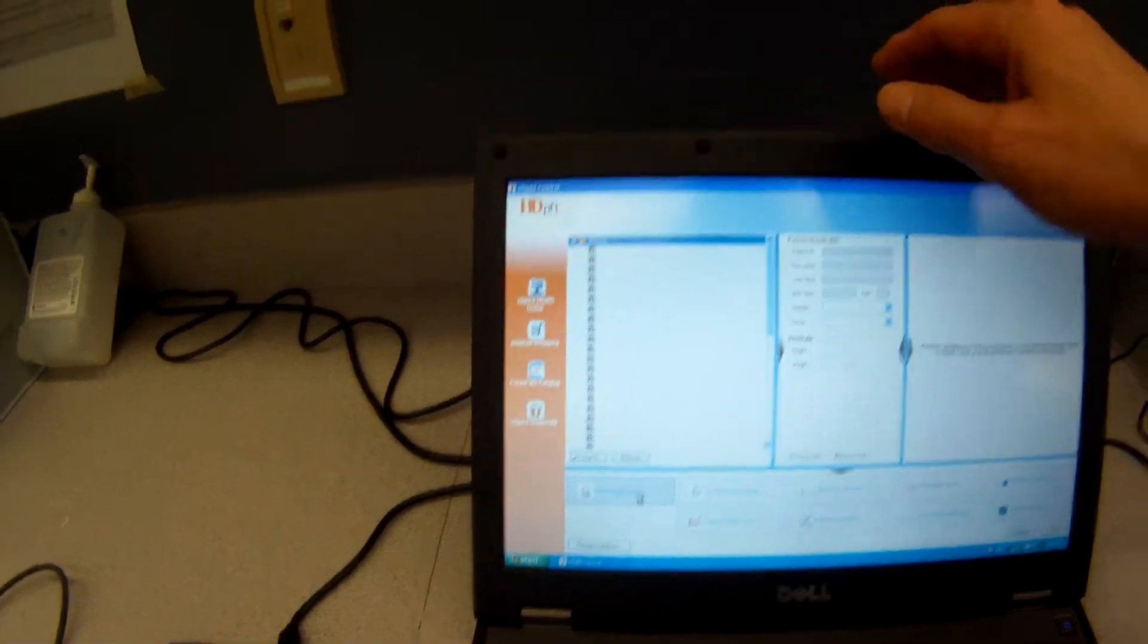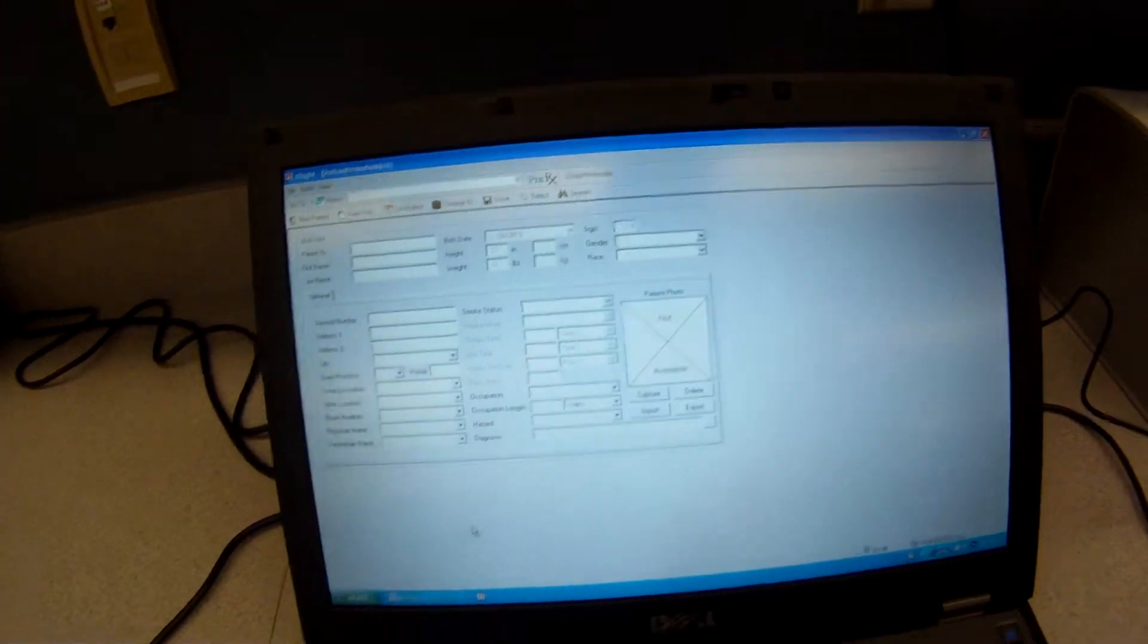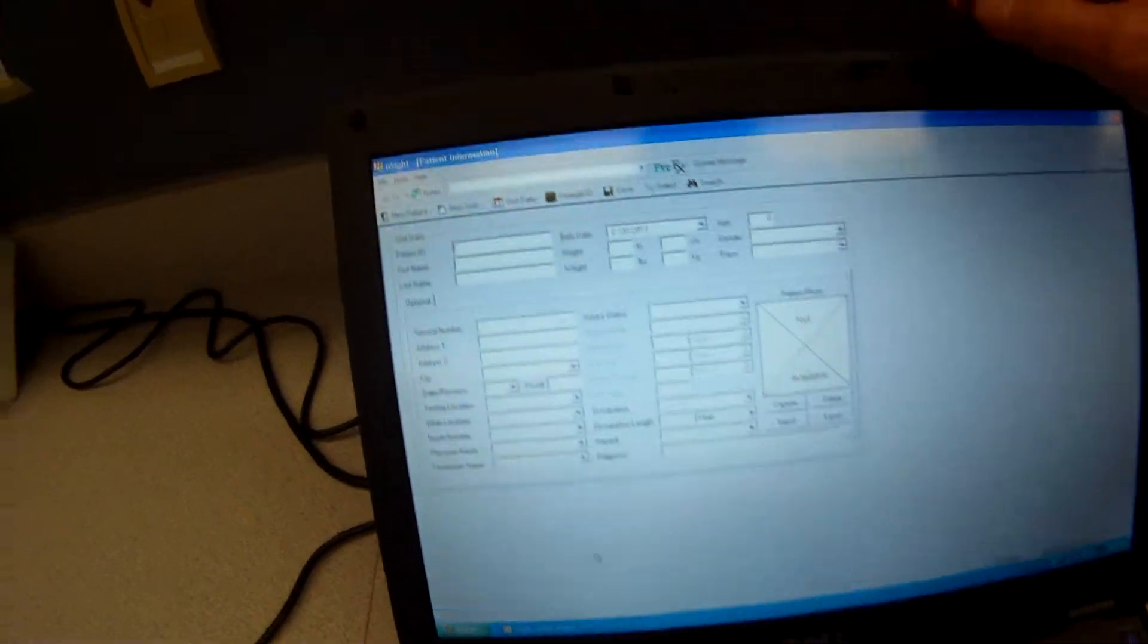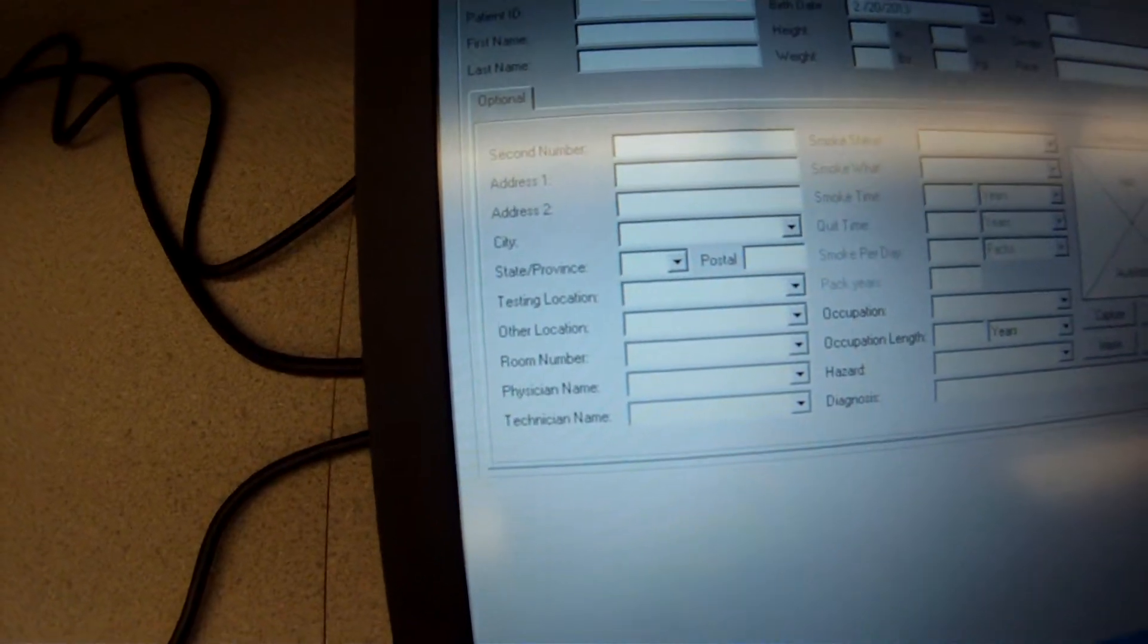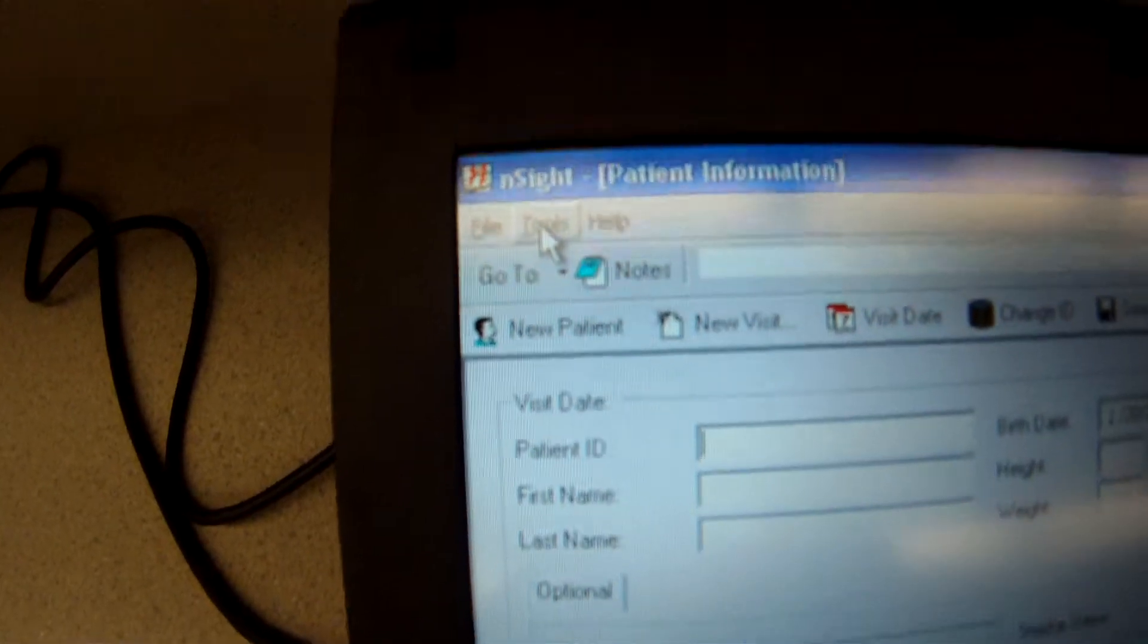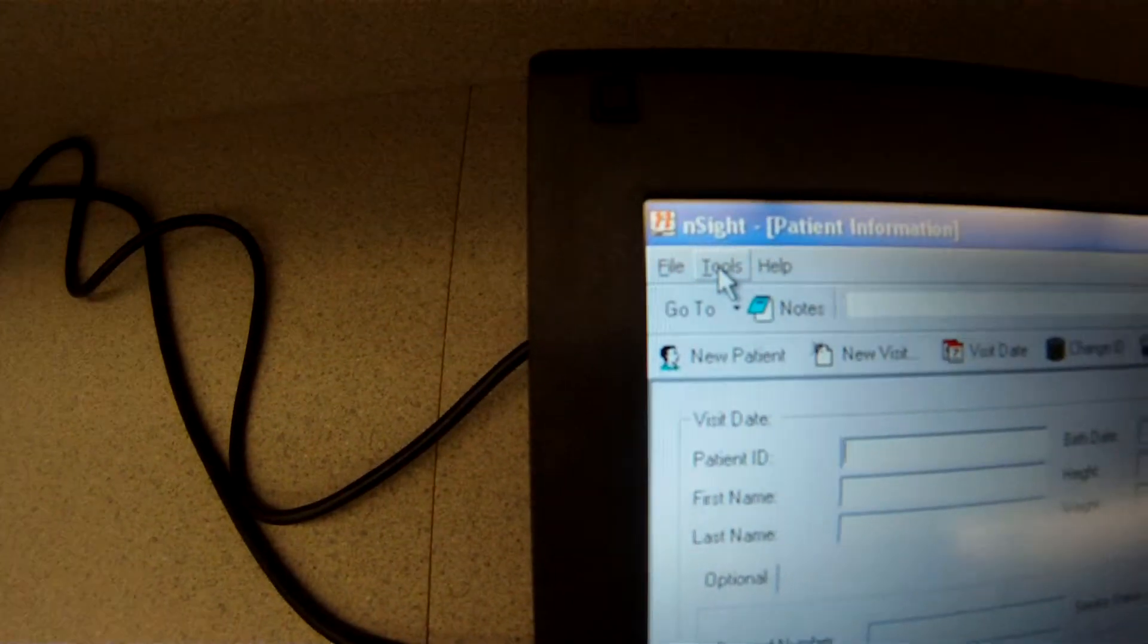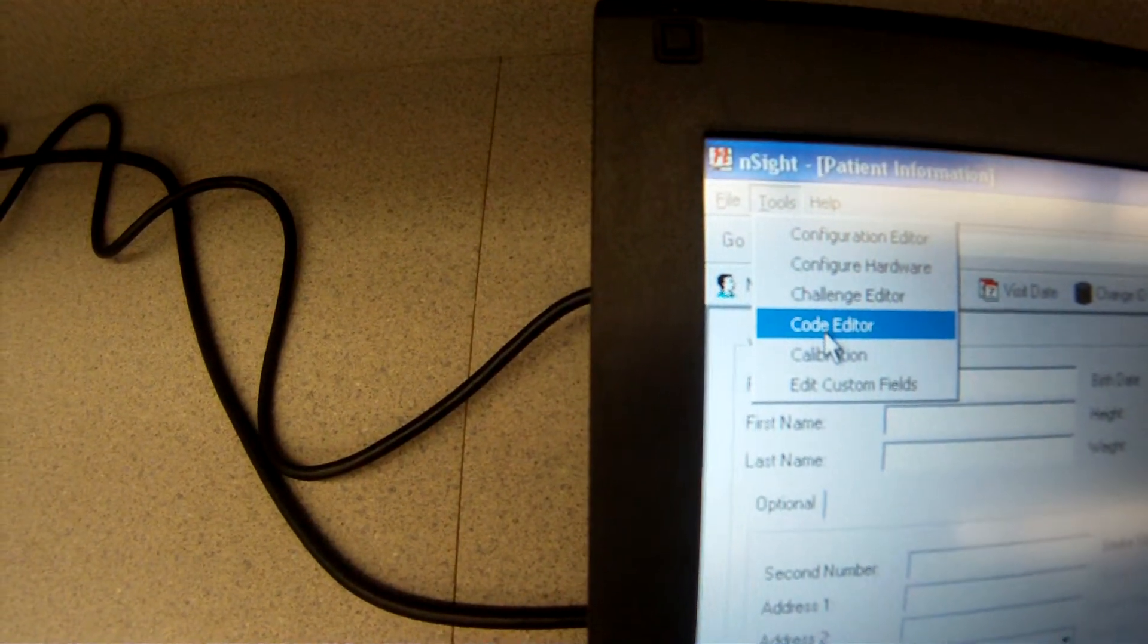We click on patient information. Give it a second here. And then it comes up with how we would start with our patient visit information, but I'm going to go right up here to tools. And under tools, I'm going to go calibration.